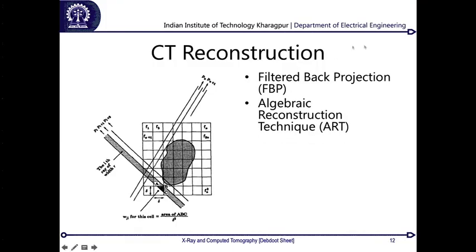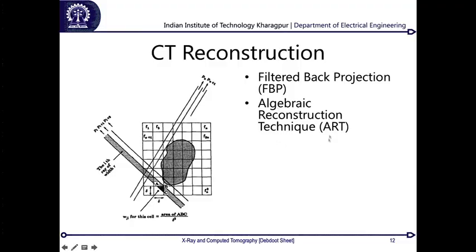Now in order to get rid of that and make techniques even simpler, there are techniques called algebraic reconstruction techniques, which rely on iterative solvers for inversion of linear equations, or the set of equations which we had seen initially and how to solve them. So they are being solved using these kind of techniques called ART.